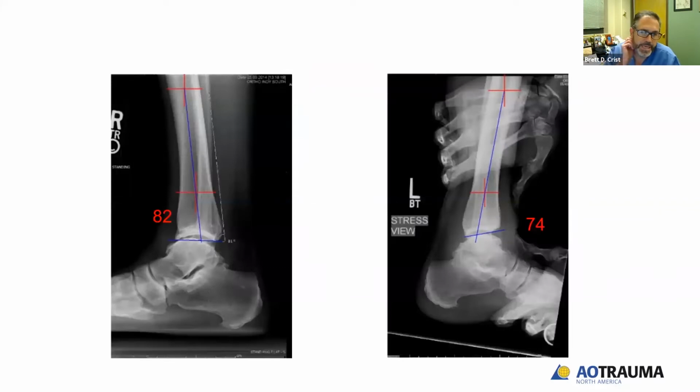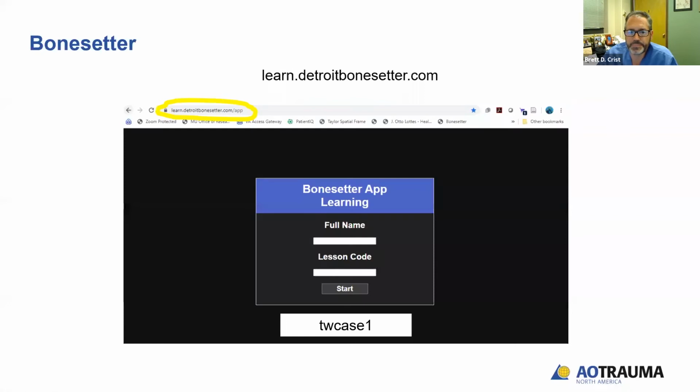And this was an interesting case of somebody who had surgery for arthritis essentially and became unstable after an anterior cheilectomy. And this is with him putting manual stress on the lateral image in clinic. You can see that the anterior distal tibial angle is significant at 74 when it should be around 80.